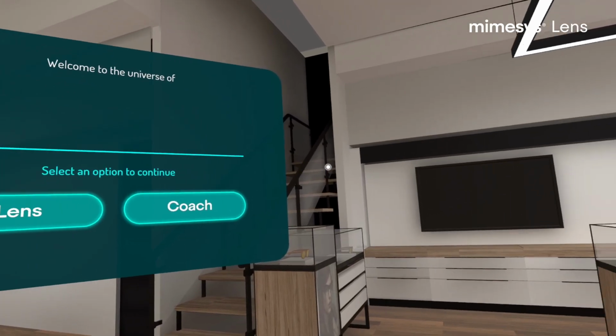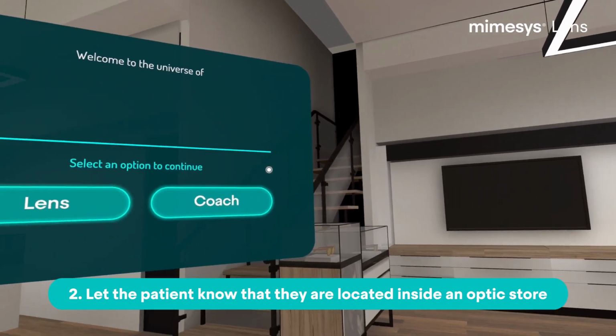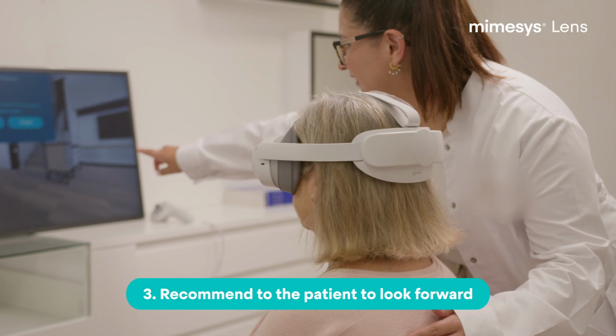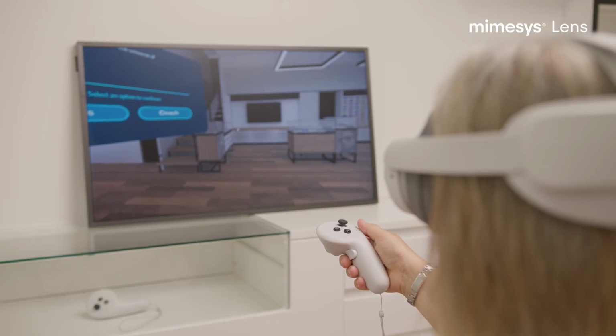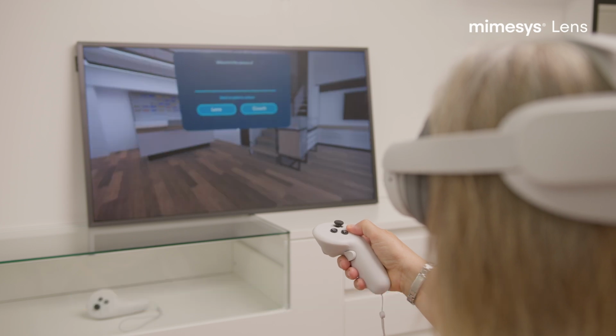To familiarize the patient with the current VR environment, let them know they are located inside the optics store. Recommend the patient to look forward. When the app's display appears rotated, you can adjust it by clicking the O button from the command.